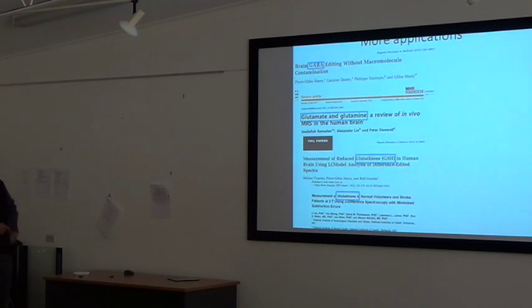And for more applications, the ones I just talked about involve the seven dwarfs like NAA, creatine or MI, but there are actually some other little creatures under those seven dwarfs, like GABA and glutathione, and separating the twins, glutamate and glutamine, is very important as well.